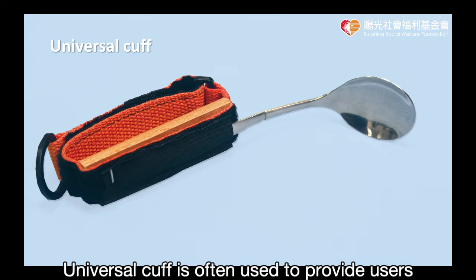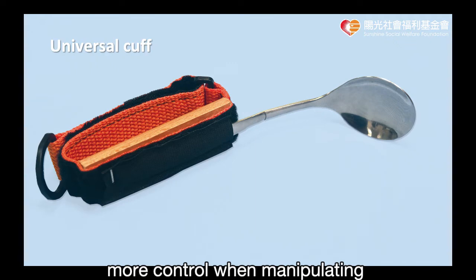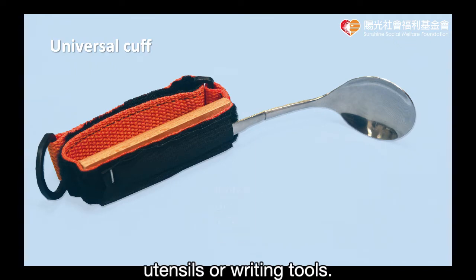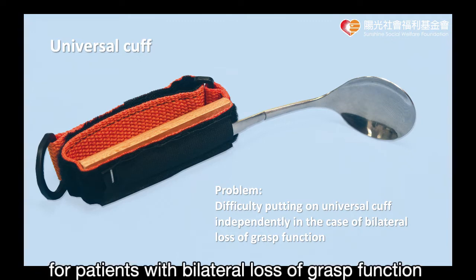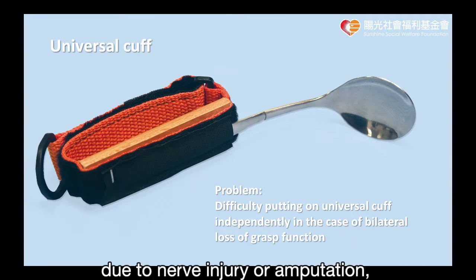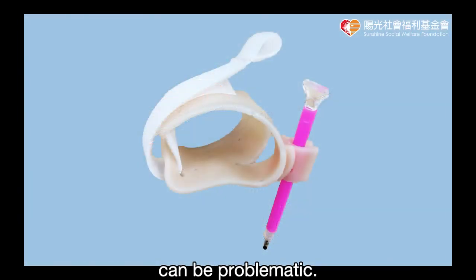Universal Cuff is often used to provide users with limited grip strength and dexterity more control when manipulating utensils or writing tools. However, for patients with bilateral loss of grasp function due to nerve injury or amputation, putting on the universal cuff independently can be problematic.